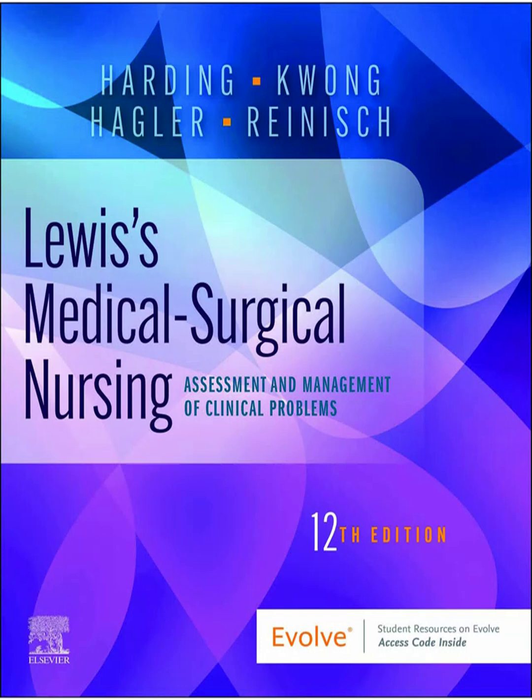Teaching for permanent pacemakers. Similar to ICDs in many ways. Regular follow-up is crucial. Watch for infection. Incision care. Limit arm and shoulder activity on that side initially. Avoid direct blows. Avoid strong electromagnetic fields, though things like microwave ovens are generally safe now. Airport security, again, walk through, show the card. A key thing is teaching them how to take their own pulse daily and to report it to their doctor if it's consistently below the pacemaker's set rate. Wear medical alert ID, carry the card.